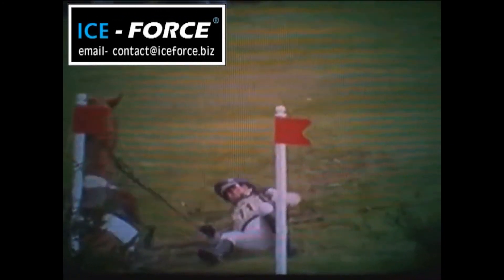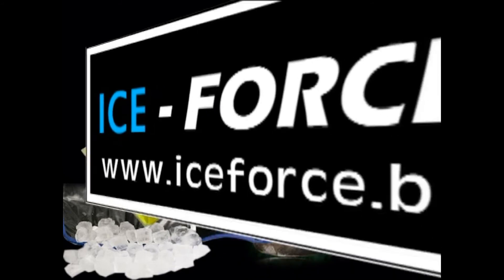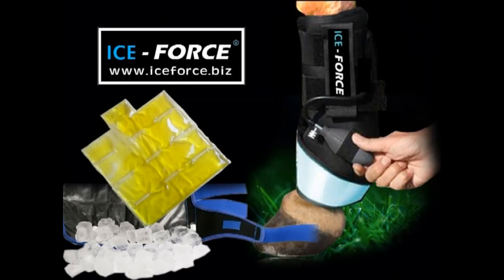Quite often, riders get injured too. Try them on yourself. Ice Force Pressure Therapy Boots are the right choice for your equine therapy needs.